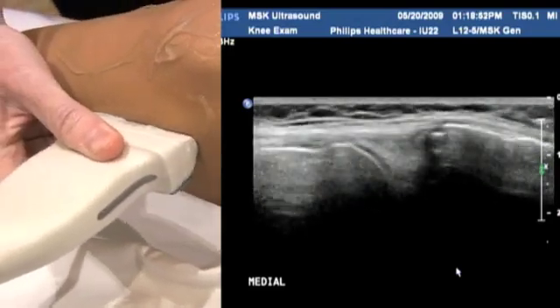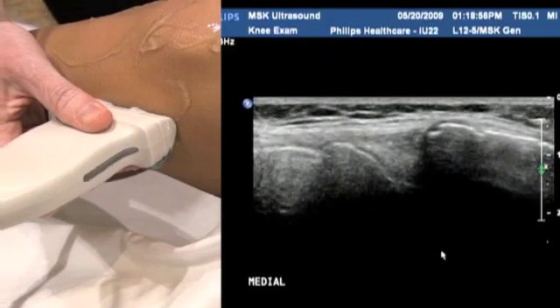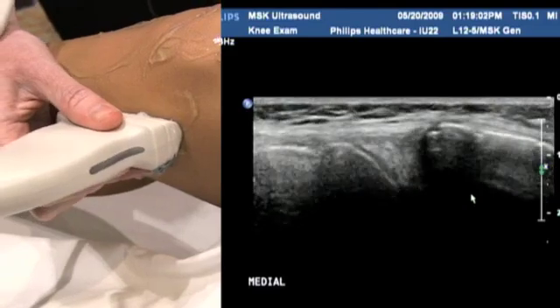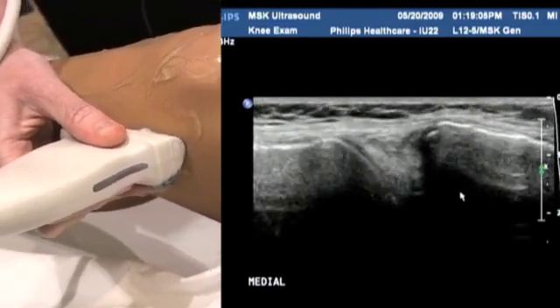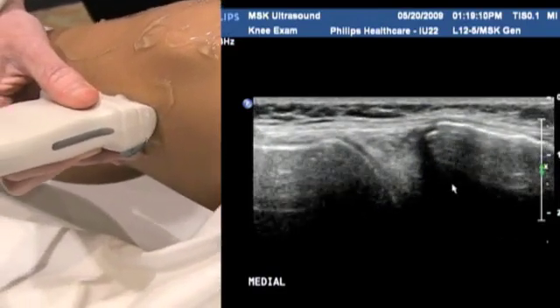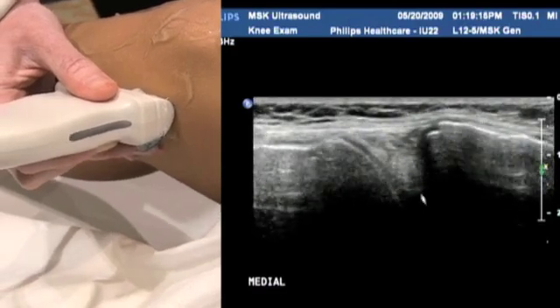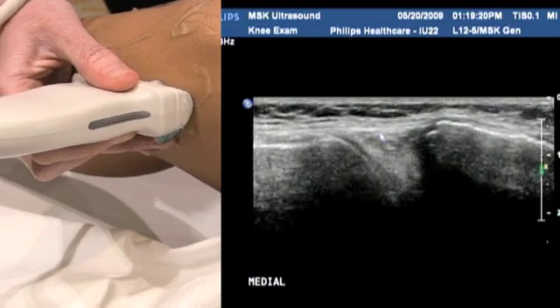So again, looks similar to the lateral side. The medial meniscus can appear a little wider top to bottom. That's normal, it's not a sign of widening of the joint at all. That's just the normal anatomical structure. Again, quite an echogenic medial meniscus now. Again, you're looking for continuity, you're looking for any sort of fissuring going down through here. Or any sort of bulging is the other thing you can get from the meniscus.